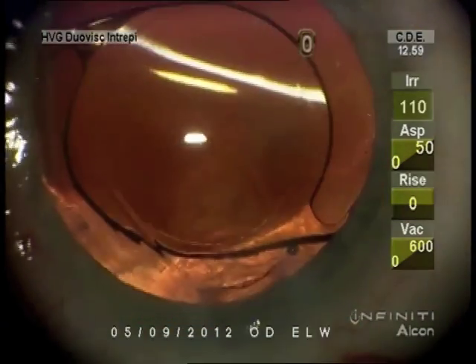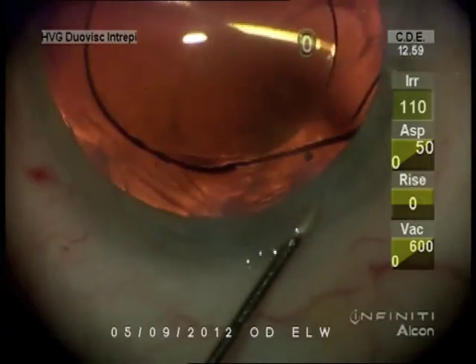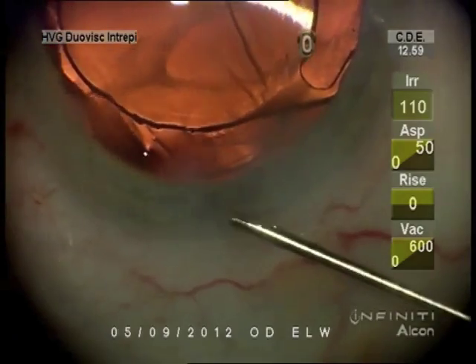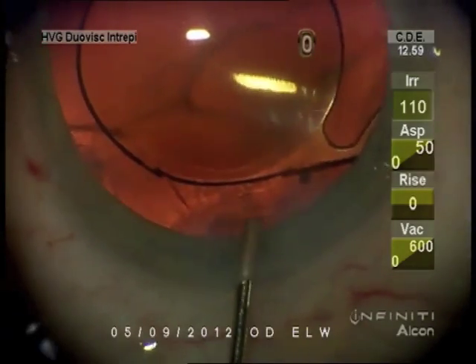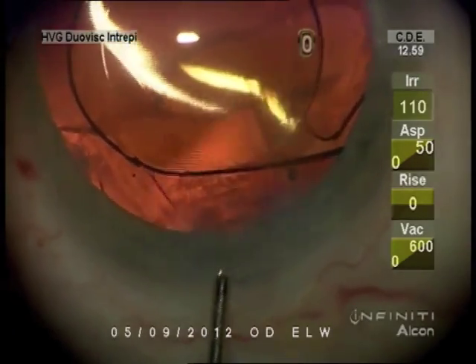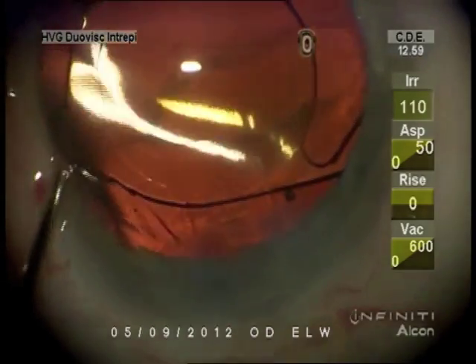And I moved it around to be perpendicular to the paracentesis. Because I want to get under it with the vancomycin. And I like to make sure that Descemet's membrane is not curled up there.